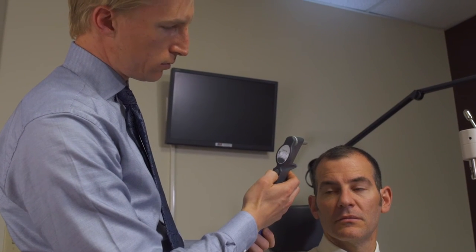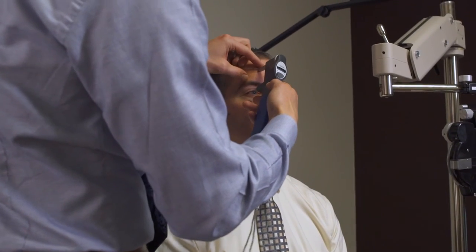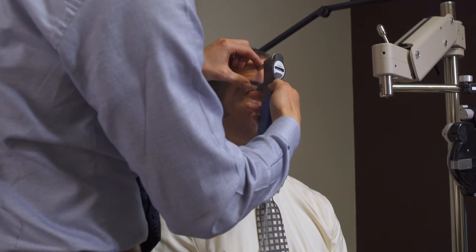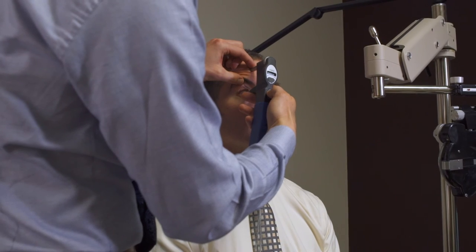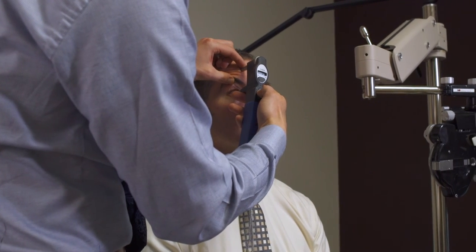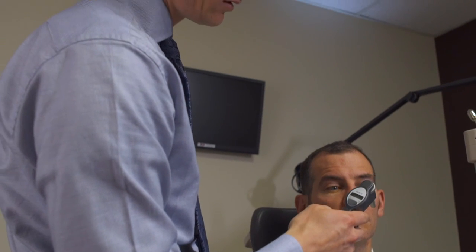The lower button is pressed to extend the tip and check pressure — here it's giving an error because it's not hitting anything when it extends. We reset and proceed by resting the upper bar against the patient's forehead, then repeatedly press to bounce that off the patient's cornea. We get our output — in this case, 12.